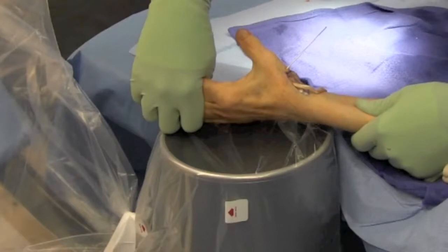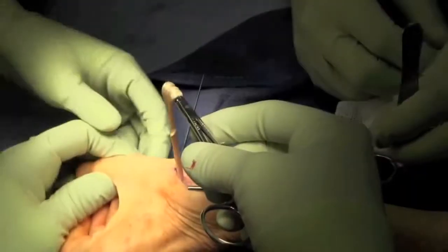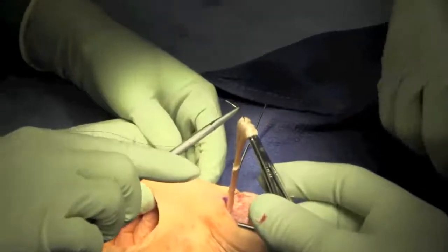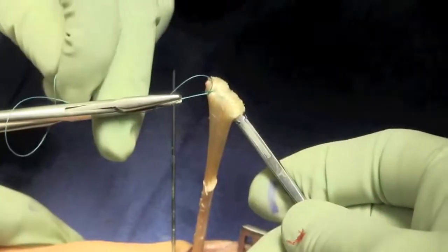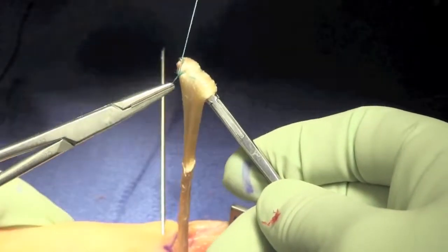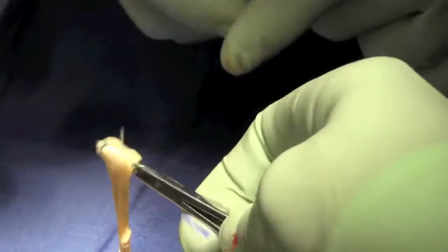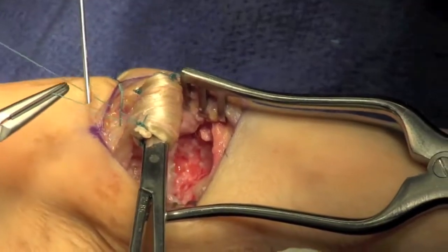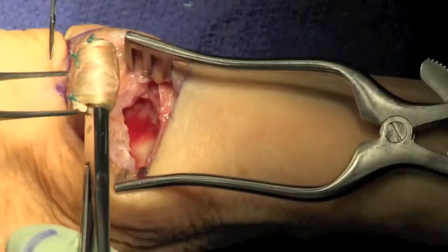Position of the thumb was then checked, and the anchovy was then made using 4-0 Ticron, rolling the flexor carpi radialis and placing it into the defect.